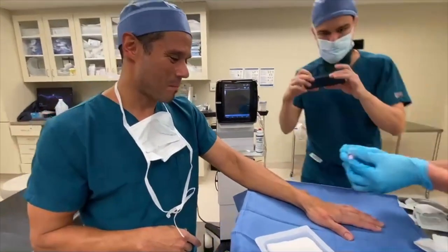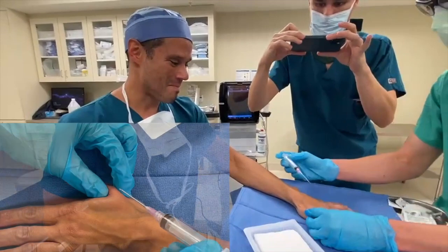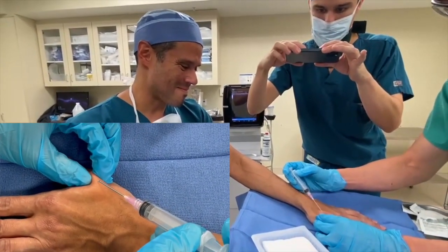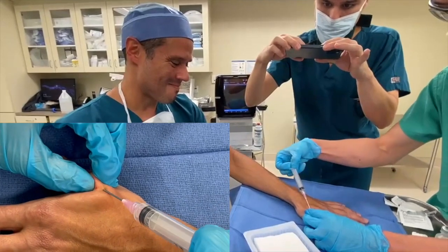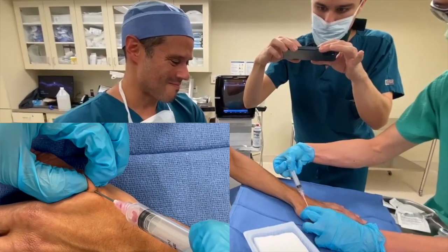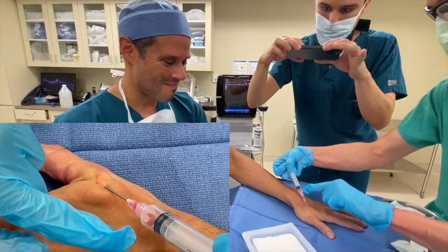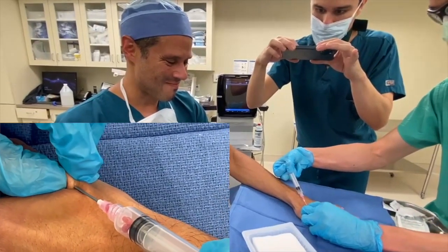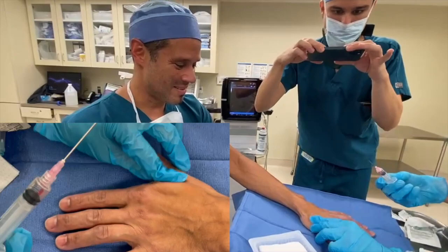So 18-gauge needle — we've already numbed them up. Feel the cyst. Ready? Set. Go. Yeah, there's a bloody cyst. See the stuff inside? So it's already drained now. It's gone now, Ricky.